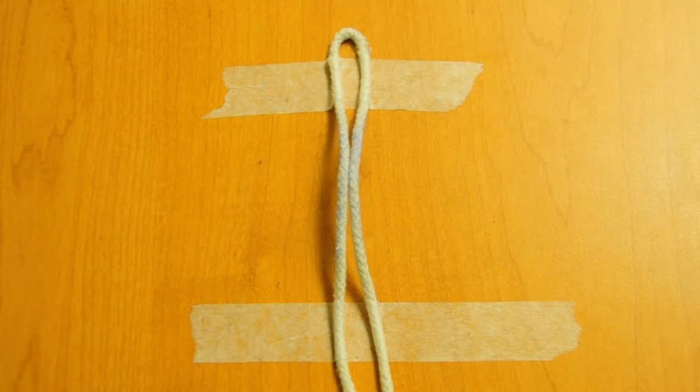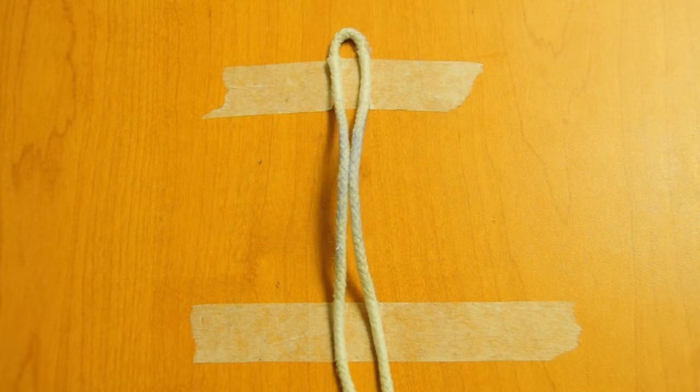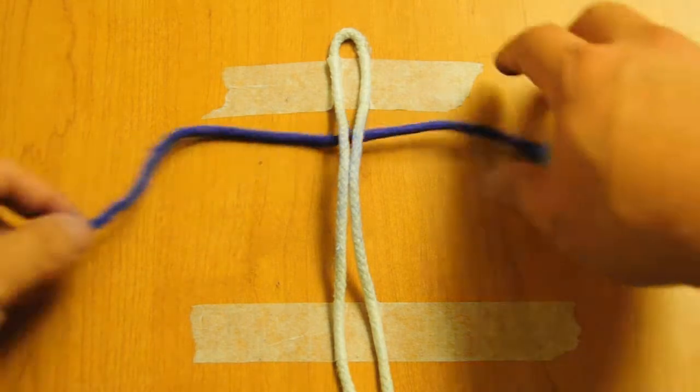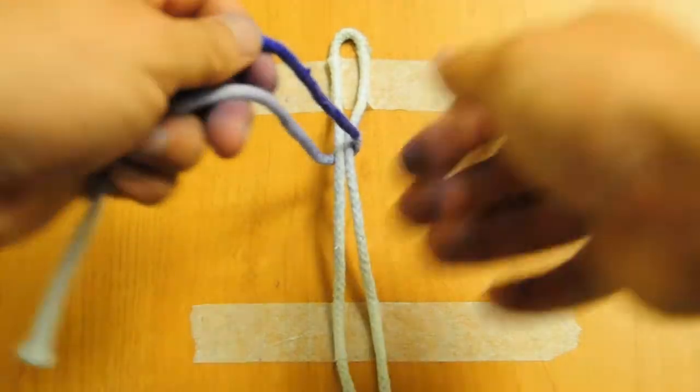Here in this video we're going to try to demonstrate the importance of equal tension on both your strands when you're tying one-handed knots, which is very hard to do sometimes when there's limited room down in the pelvis, but this is what you're supposed to do, and we're going to try to show the difference and why it's important.